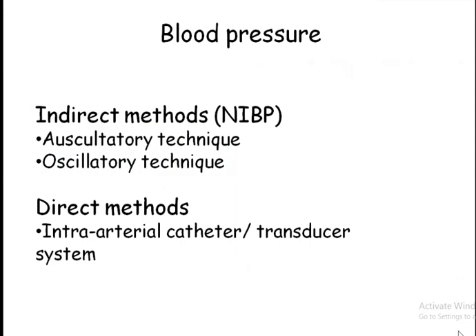Okay, now coming to another method, that is measuring the blood pressure. You all must be measuring the blood pressure on your own, and you must know it thoroughly, because this must have been covered in your physiology classes and practicals. There are indirect methods and direct methods. We'll be stressing more on the direct method, but just an overview: the auscultatory technique and the oscillatory technique in non-invasive blood pressure monitoring. In our ICU monitors, we have both types of measurement. We can do it non-invasively and invasively.